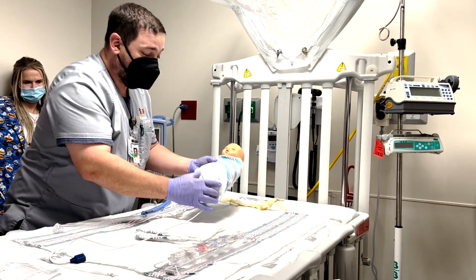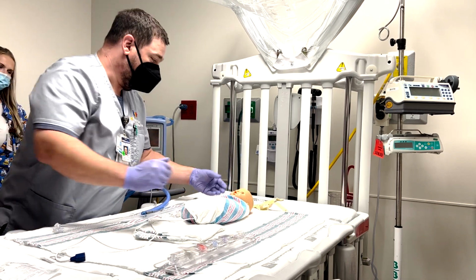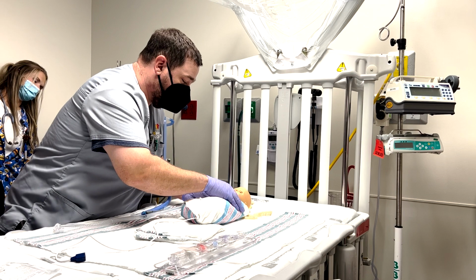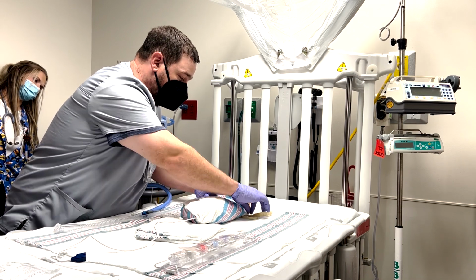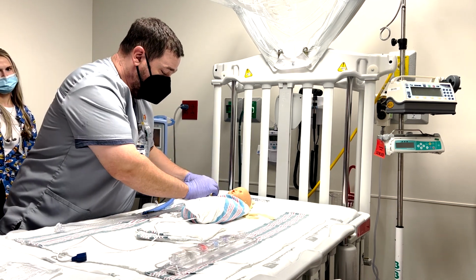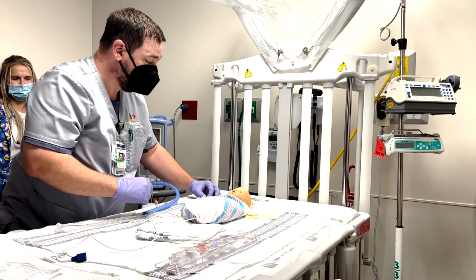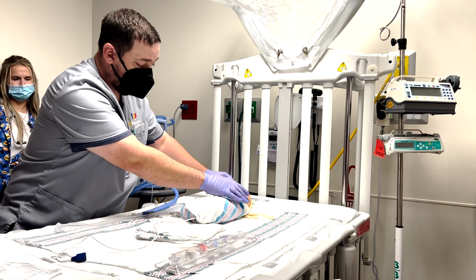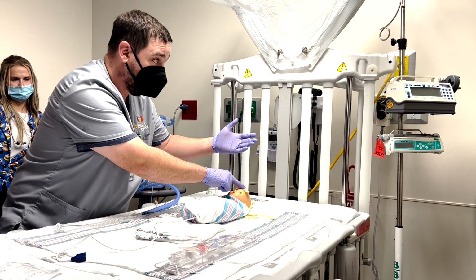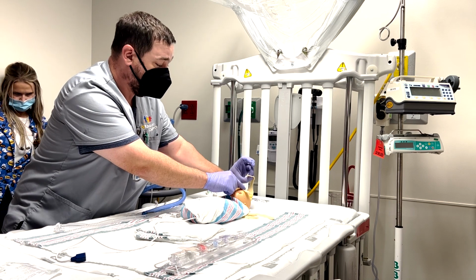The easiest way to do things is to swaddle the baby, because they will try to help, and it's no help to us. So however we lift the child, set their head right where that basket is, and down across the nape of the neck there. What's really cool about these is they're numbered on the edge, so you know what goes first. You have number 1 on the edge here. So you put that across, and you have to hold it in place. See what I mean, if the baby's helping you and I'm trying to do this by myself, it's not very fun.